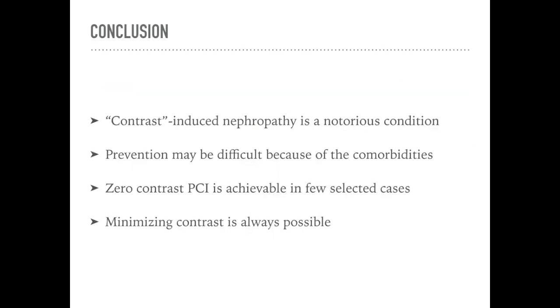So to conclude, contrast nephropathy is one of the most notorious conditions for patients and for interventionists. We should do all we can to prevent it, although it sometimes would be very difficult because of the patient's comorbidities. Trying to achieve zero-contrast PCI is feasible only in some selected conditions, but in most cases, minimizing the contrast dose to the minimum is possible through using the tools that we described.